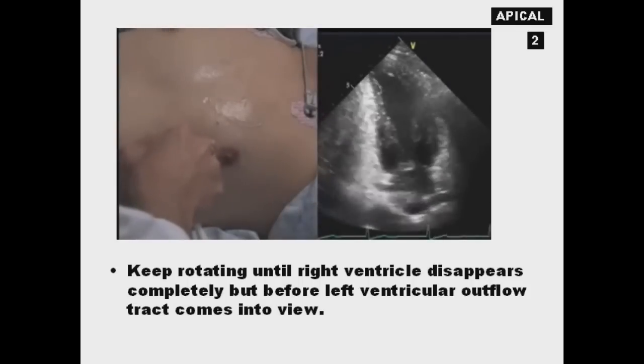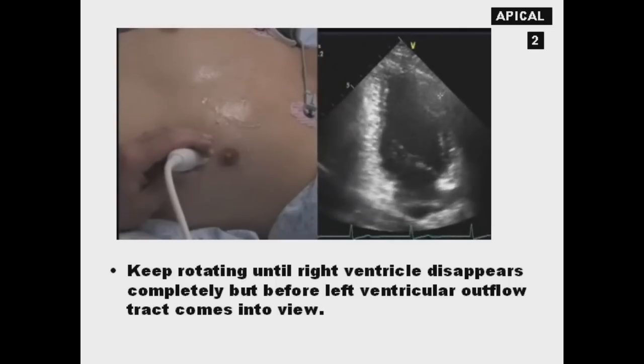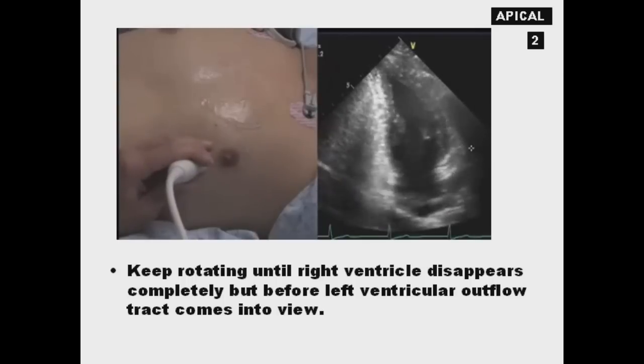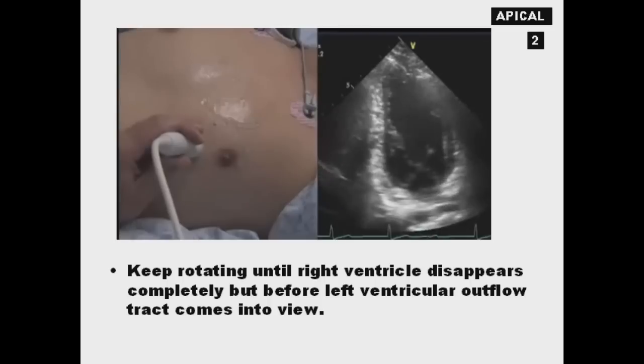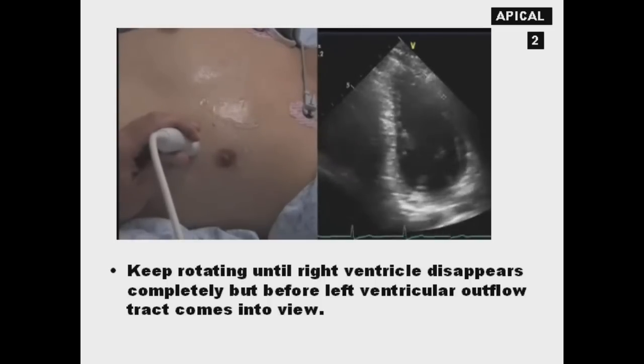Let me switch over to the 2-chamber view. Quite often, one wall or the other will be difficult to see. We want to make sure we're seeing them both well, and in that case you may need to just change your position on the chest, change your angle a little bit. Often it's the inferior wall that is well seen and the anterior wall is not so well seen. As we can see here, it's falling out.